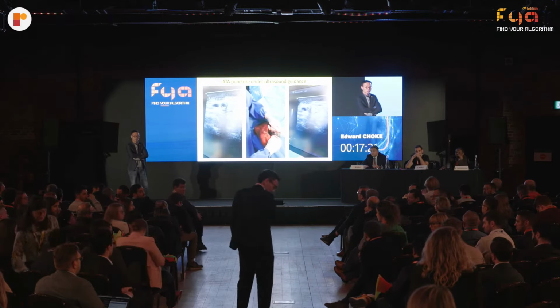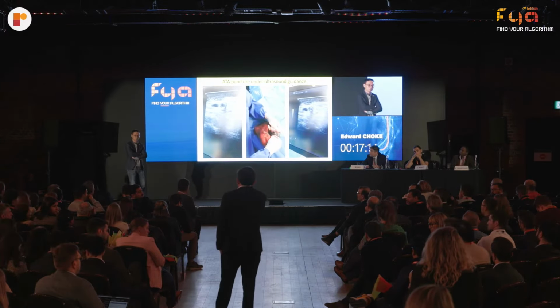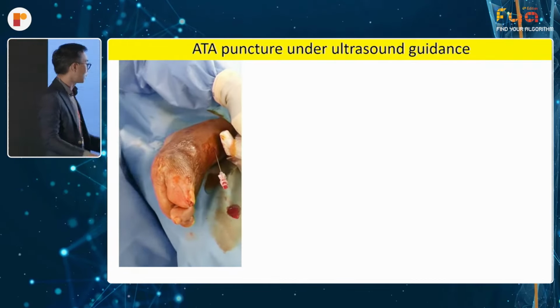But in the other way, with the PT, I'm sorry, I don't want to cover something you're about to say. Are you about to talk about PT? Yeah, as well, yes. Okay, fine. So I'm going to go through. So once you've entered it, then you see this nice flashback and you know you're in business.